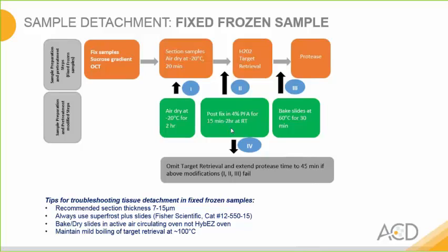We found that the majority of sample detachment actually happens after the target retrieval step. And so we recommend adding this additional baking step before the protease step. So if you tried all the above steps and you're still observing detachment, you can omit the target retrieval step and just go directly to using the extended protease time of 45 minutes. Also, please contact support, and we can help address the best troubleshooting path for this issue.